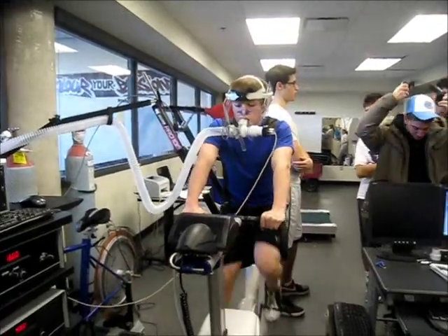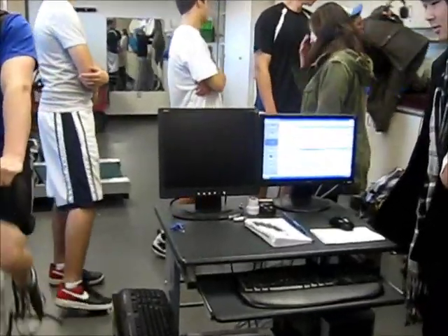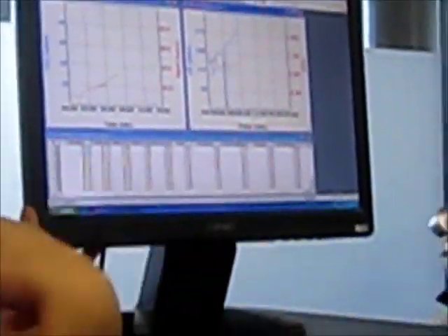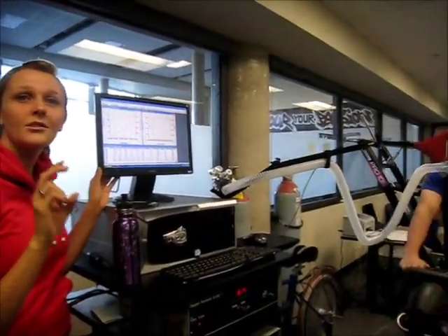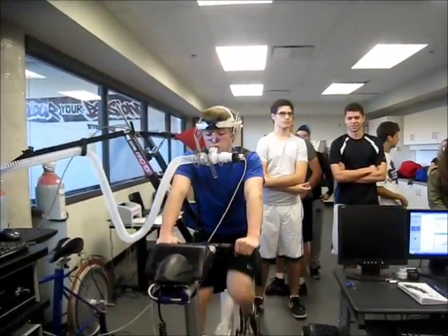I see those two numbers going in — is the one on the bottom when he's not breathing out? One is the oxygen analyzer and one is the CO2 analyzer. It's a percent — so it's just in room air and things like that. It goes through a whole series of calculations to come up with the values. His scores right now are around 30 for VO2, where 50 was the 90th percentile. We've seen it started around 5 and it's gone up to around 30 right now, and he's still got lots left. He's doing awesome.